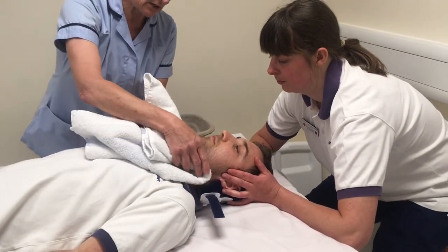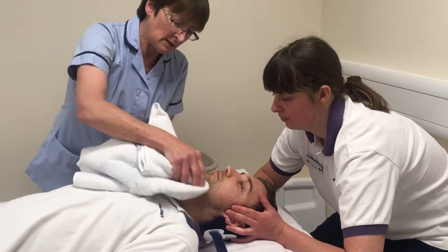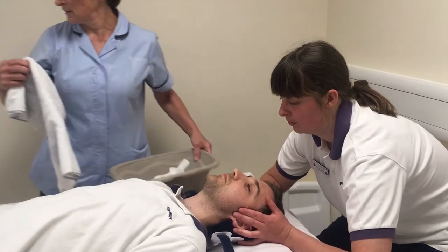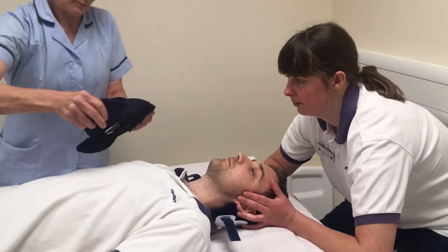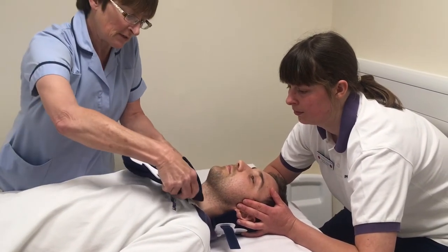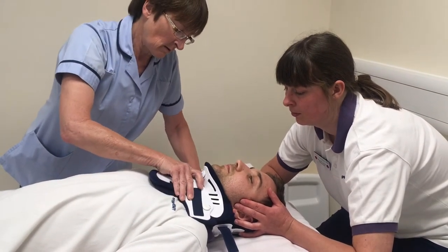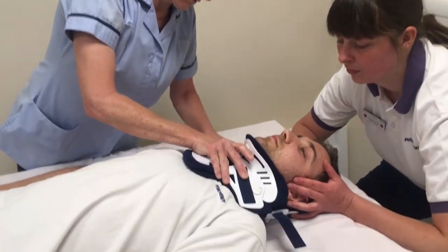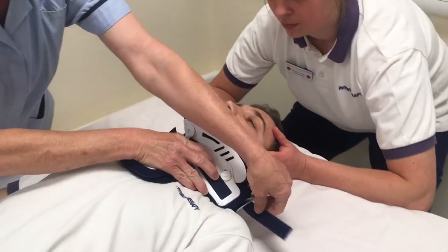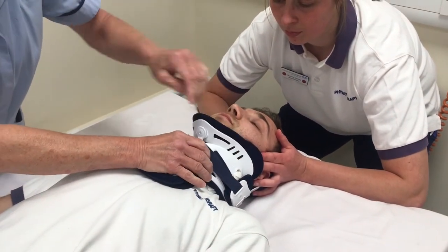Patting the skin gently dry so that we don't aggravate any sore wounds. And then we'll put the collar with the fresh liners into place and attach the strap.